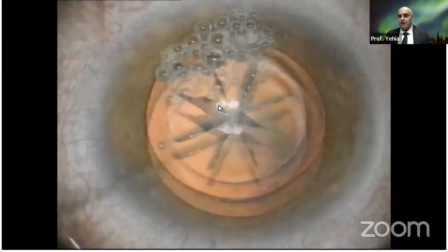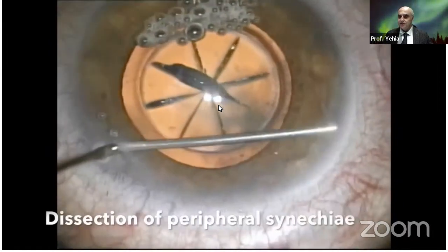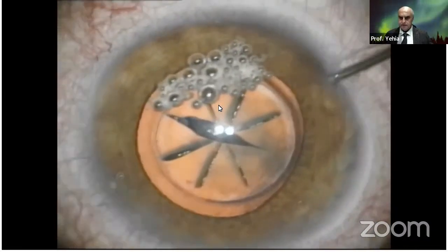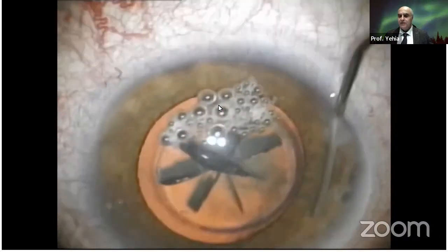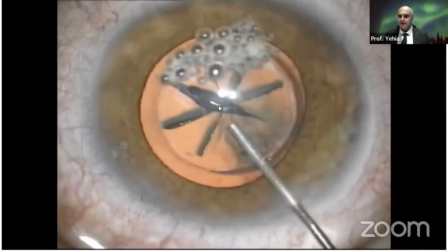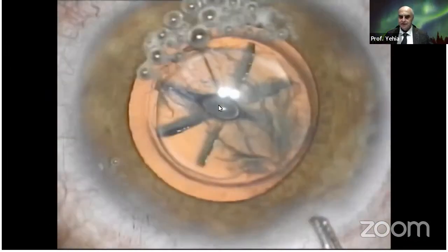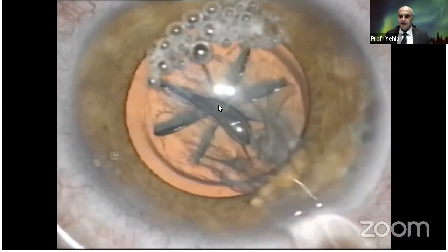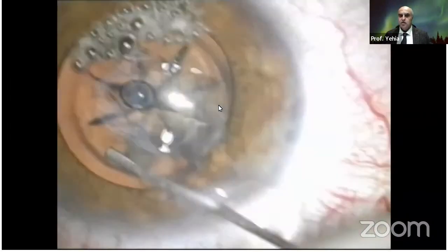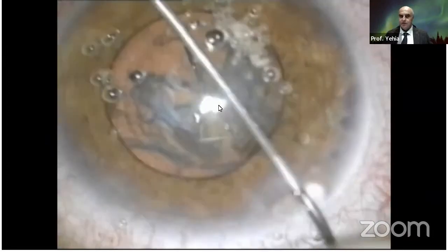So here the rexis is already done. Incisions are well constructed. I start mechanically to dissect the peripheral anterior synechia. The bubbles you see are from the femto laser. This is a very good femto laser that creates very little bubble because of the low energy. Here I'm displacing the rexis, so I have a good rexis. You can see the incision is better constructed here. I don't get the prolapse of the iris. So I'm more focused on the surgery itself, not on trying to overcome unexpected problems.